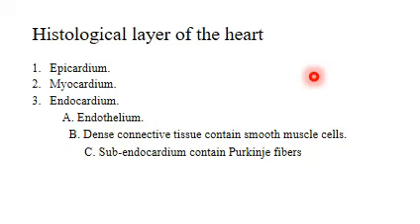The bulk of the wall of the heart is the myocardium, and the myocardium is composed almost entirely of cardiac fibers. And I would like to show the features of the cardiac muscle fiber in the next slide.